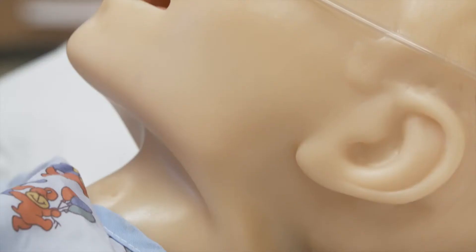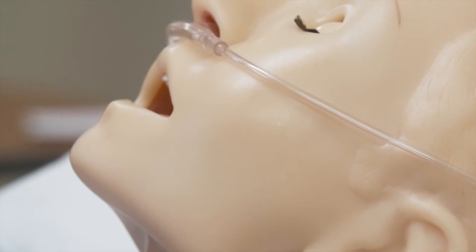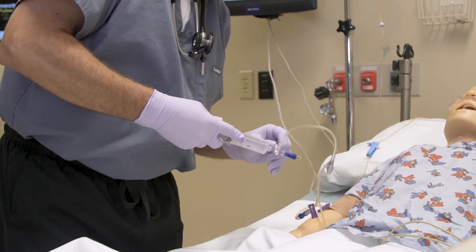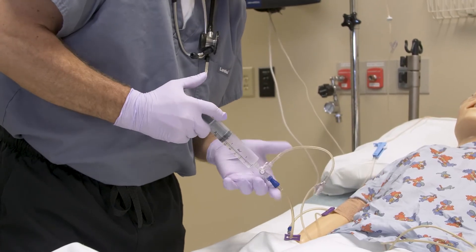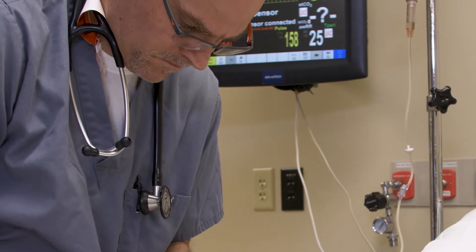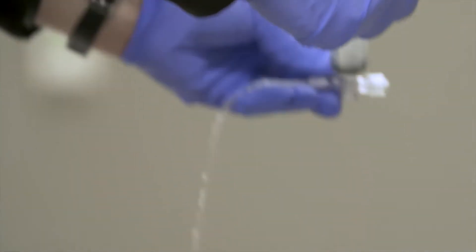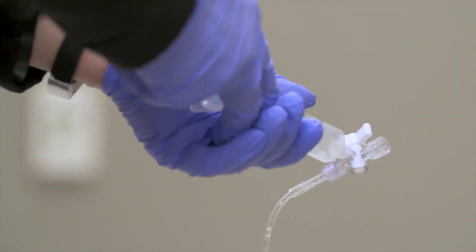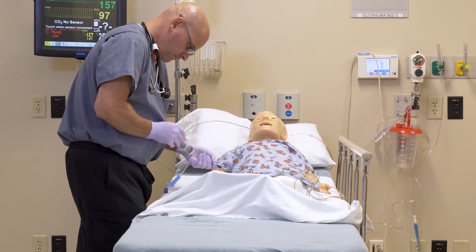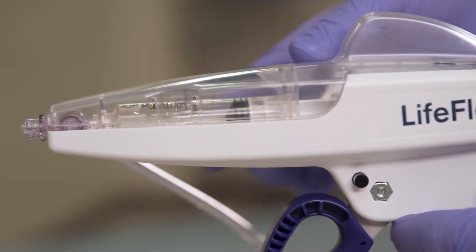In the past, a patient who requires significant fluid resuscitation in the pediatric emergency department would receive fluids by what was called a push-and-pull method. The nurse would have to pull off 10 cc's of fluid, then switch the valve and push the fluids to the patient. That works, but it's actually quite a complex procedure to set up and manage, and it takes the focus of one medical provider all of their time to administer the fluid. This is tedious and impairs your ability to rapidly infuse fluids. The Life Flow can replace that technique, take the complexity out of it, and make it much more intuitive.